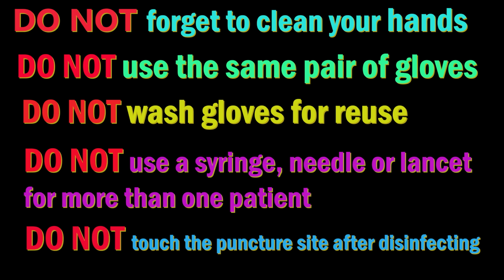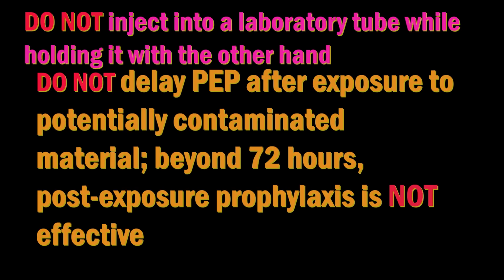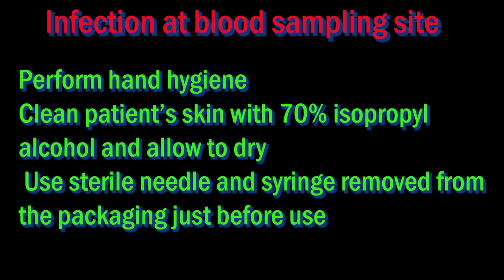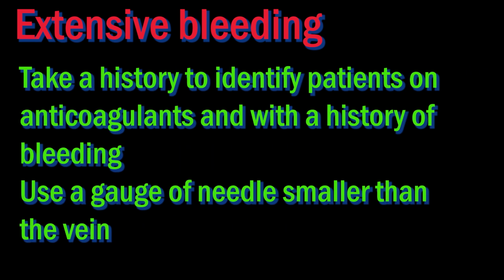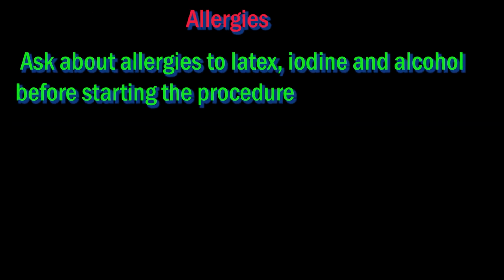Inform the patient when the procedure is over. Ask the patient how they are feeling. Check the insertion site to verify that it is not bleeding. Then thank the patient. Clean up spills of blood. If blood spillage has occurred because a laboratory sample broke in the phlebotomy area or during transportation, or because of excessive bleeding during the procedure, clean it with paper towel, wearing gloves and apron. Clean it with disinfectant and allow it to dry before the next patient collection is done.